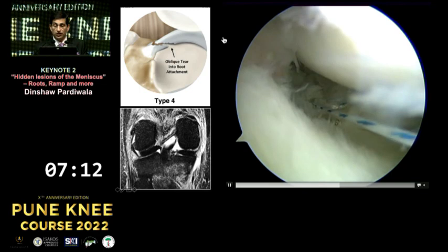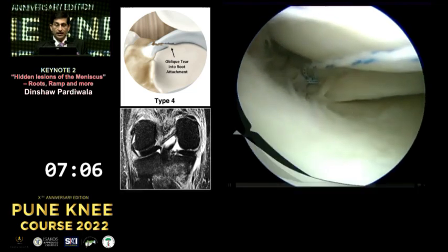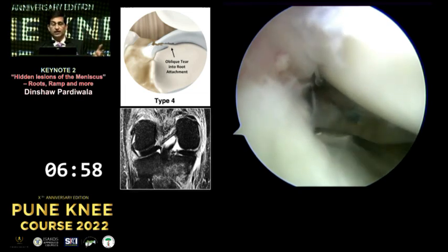So you need to put in a hybrid sort of suture there. So one pull out with a cinch, and then you can use an all inside and again get an end-to-end restoration. And that end-to-end restoration in this part, because you freshen the bone, you'll get a good blood clot there. This is going to heal.